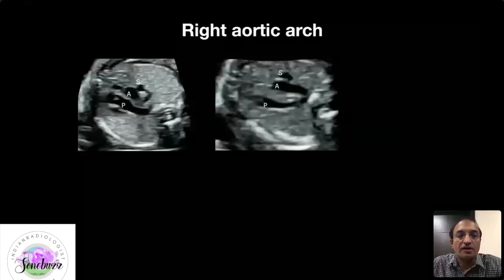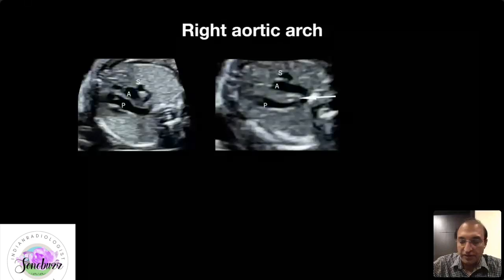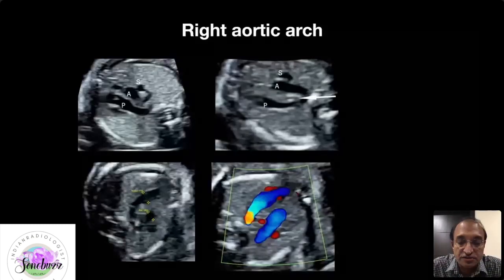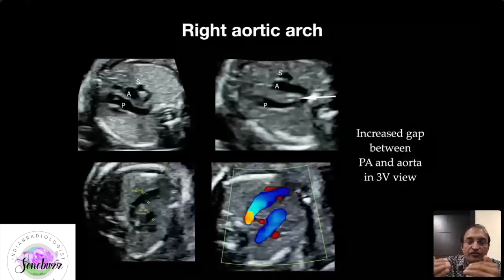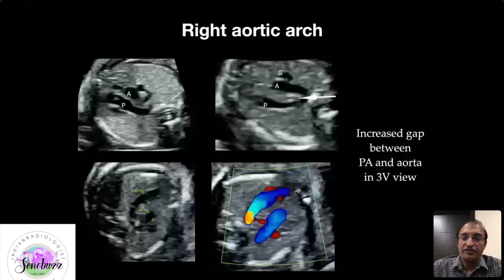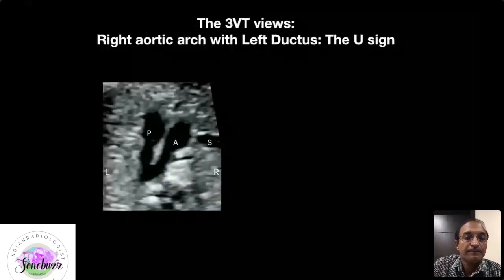Then we have right aortic arch. To compare the two pictures: S is superior vena cava, A is aorta, and P is pulmonary artery. In right aortic arch there is an increased gap between the aorta and pulmonary artery, because normally the aorta moves leftward toward the PA in the left arch, but in the right arch it stays on the right side. This increased gap between the aorta and the PA is a very useful clue for right aortic arch.